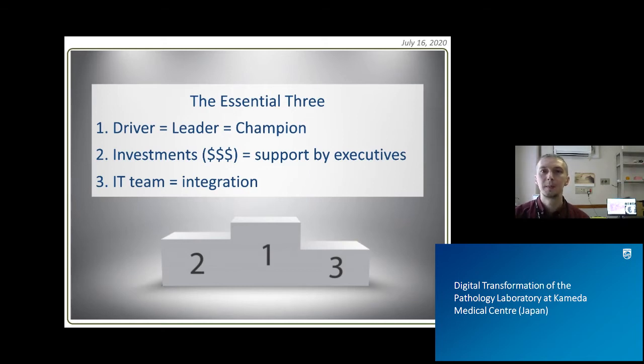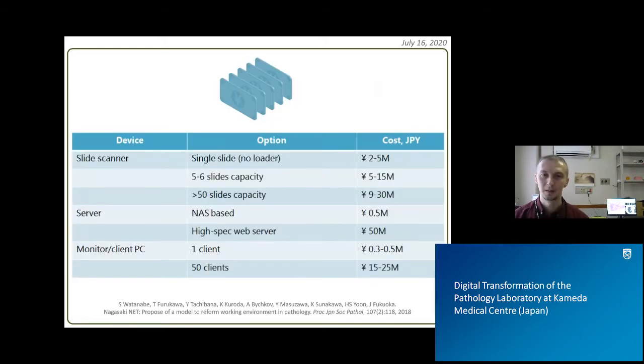One of the topics I may comment on here is money, because it's a favorite topic, to be honest. When people make presentations about the basics of digital pathology and implementation, almost nobody shows how much money they spend. Well, I'm quite transparent with you, and these are the approximate costs of our equipment, including scanner, server and infrastructure.